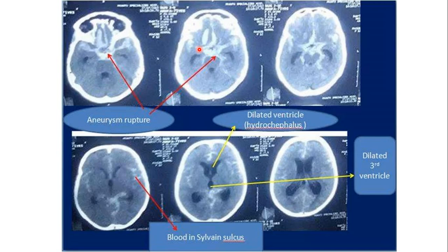A small coil wire is placed within the aneurysm, causing it to clot and stopping the bleeding. Alternatively, surgical clipping of the ruptured aneurysm can be performed. You can also see the dilated temporal horns of the lateral ventricle — not seen normally — indicating early onset hydrocephalus.